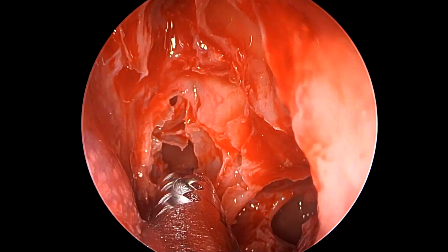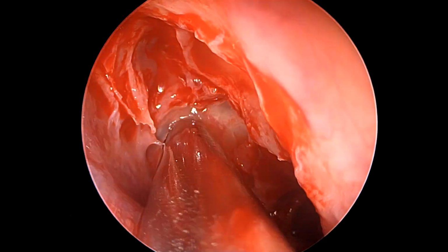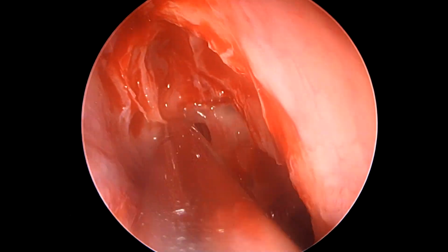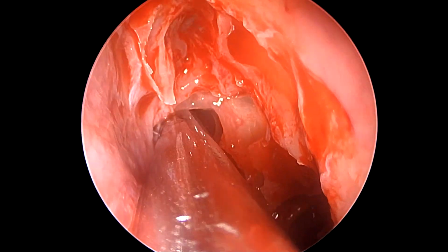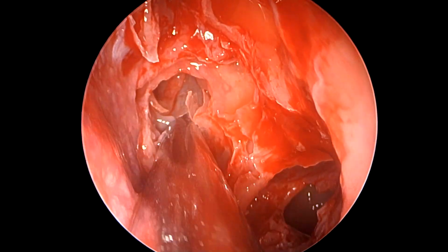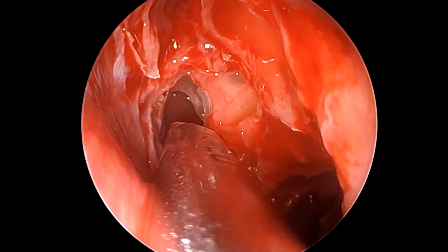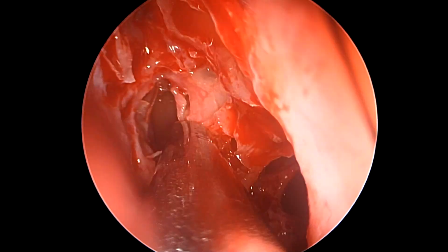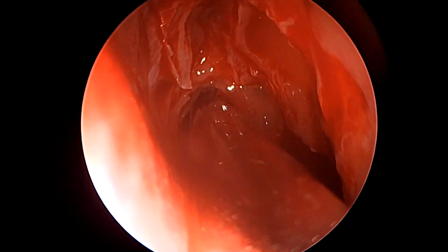Plenty of irrigation at the same time keeps our vision good and reduces the surgical time and the surgical frustration of repeatedly removing the endoscope every now and then to be able to see better. So here we have punctured the basal lamella, we are into the posterior ethmoid cavity. Soon we shall again be encountering the superior turbinate and hence the sphenoid sinus.